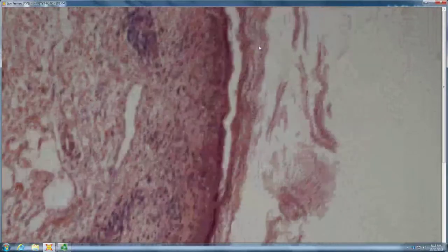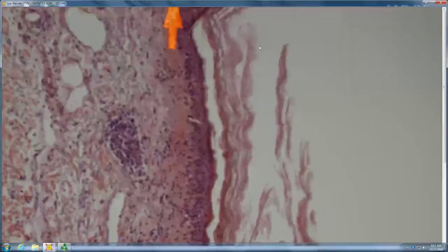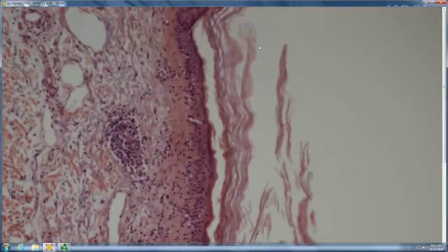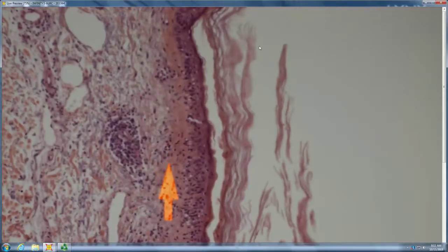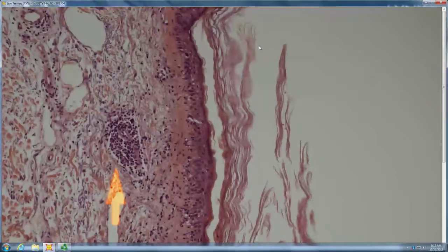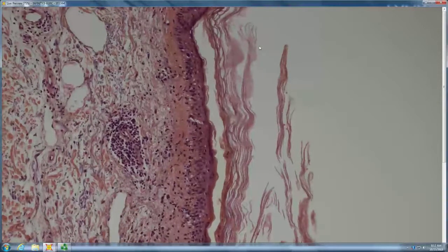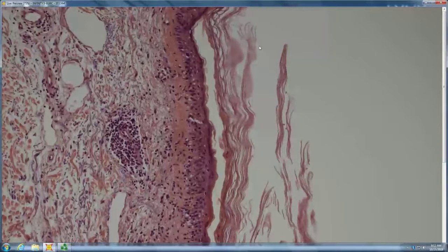Superficial perivascular infiltrate. It looks like at the junction you got some lymphocytes lining up. Some fibrosis, potentially like MF. So if there were fibrosis, you might think of mycosis fungoides. Tell me about the infiltrate around the vessel. Is that MF-like? It's a little more bottom heavy, I guess. It's more bottom heavy, right? MF should be a bare underbelly and top heavy, right? So that doesn't really fit.